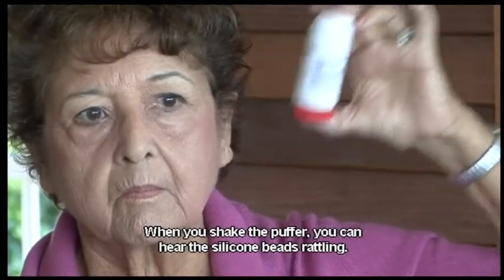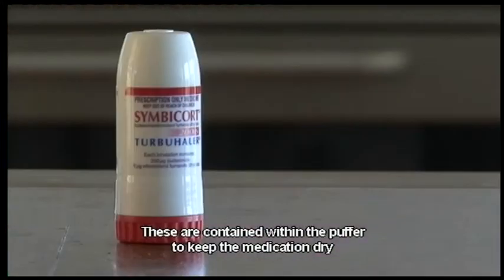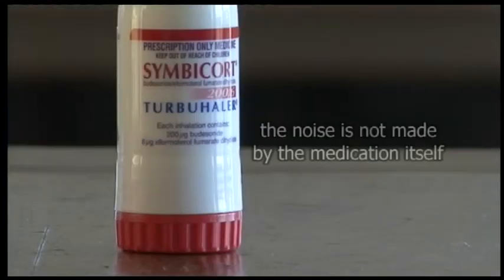When you shake the puffer, you can hear the silicone beads rattling. These are contained within the puffer to keep the medication dry, and are no indication of how many doses are left. The noise is not made by the medication itself.